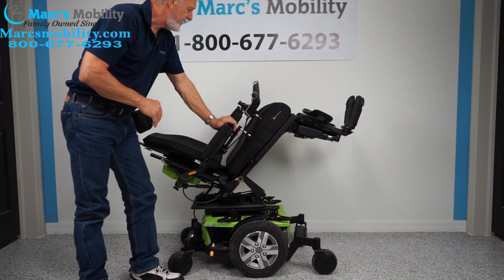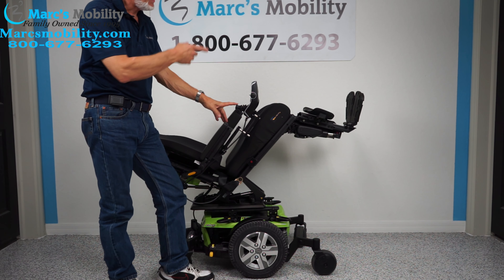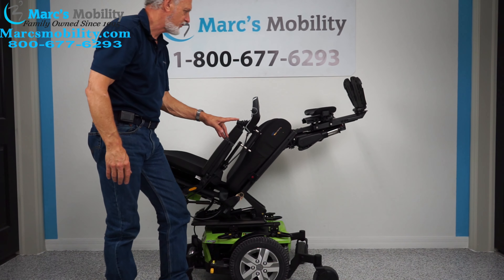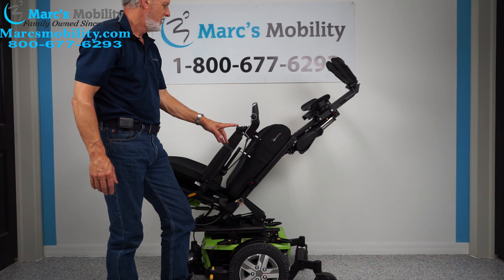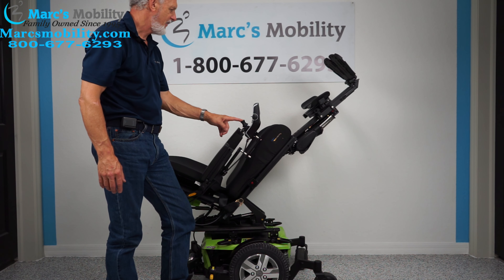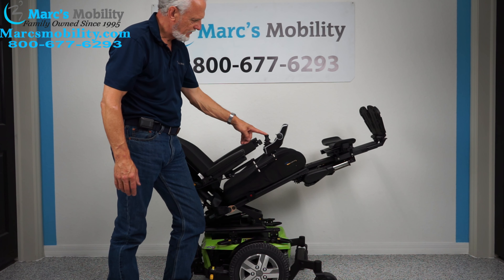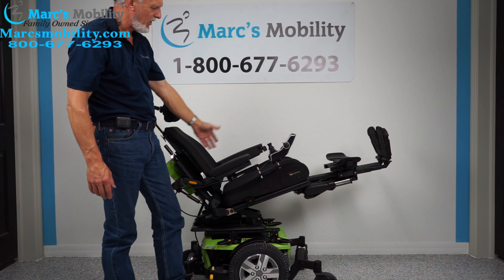We've got your seat tilted. Next I'm going to do the electric legs — these feet are going to go straight up in the air. So if you needed circulation, this would be one good way, though that might be a little extreme. But if you bring it down halfway, or three-quarters tilted, you can see your legs are still higher than your body.